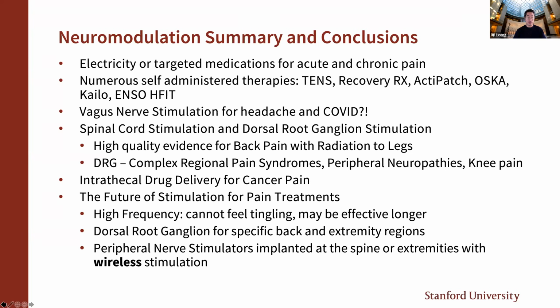And so what's the future? The future is really now. High frequency stimulation, you can't feel the tingling. Dorsal root stimulation, very specific extremity regions. And peripheral nerve stimulators can be implanted for wireless stimulation now. I think it's really fascinating how fast things have grown over the past 5 to 7 years. I've been really fortunate to be involved in the care for many people like you, and just to be involved in a fast and really interesting area of pain management.